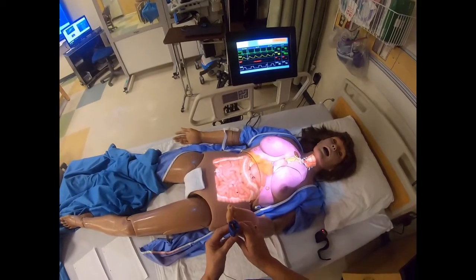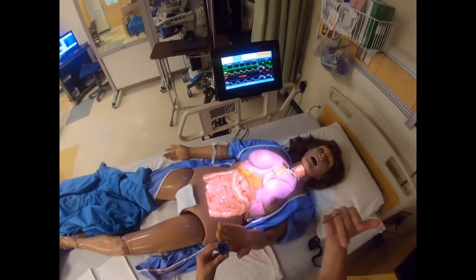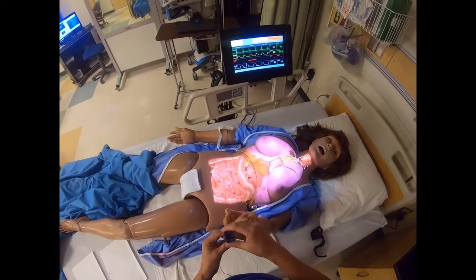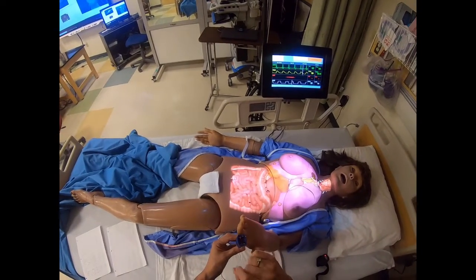Purple and red are the colors that will give us false high readings. Why do you think that purple and red are the reasons for getting false positives? Think about that, write down your answer, and we will come back.